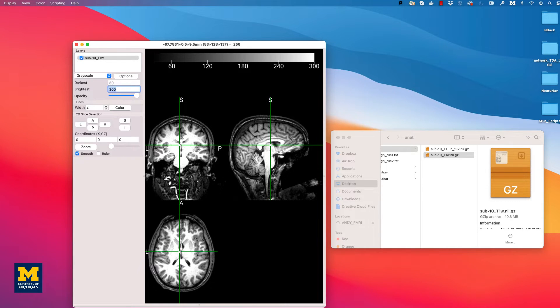For example, you may not want to see any voxels below an intensity of 30 or anything brighter than an intensity of 300. By setting the darkest threshold to 30 and the brightest threshold to 300, the darkest color — in this case black — will be set to voxels with an intensity of 30, and white will be assigned to those voxels with an intensity of 300.